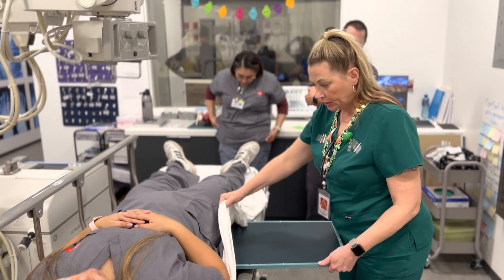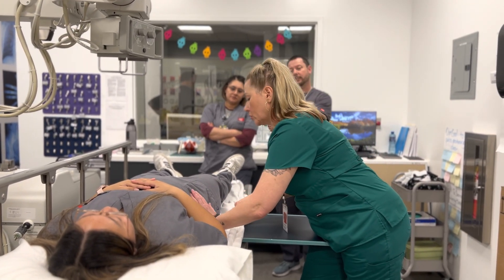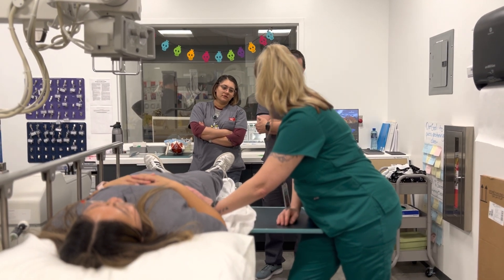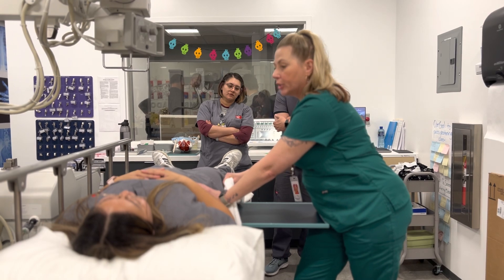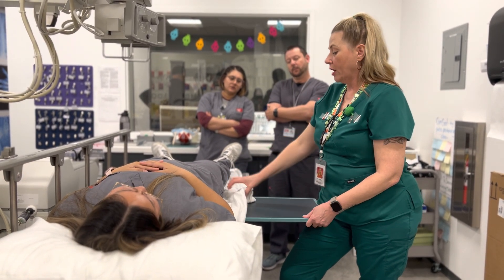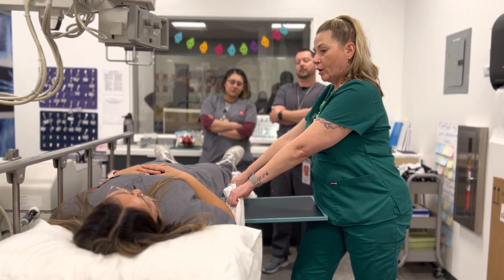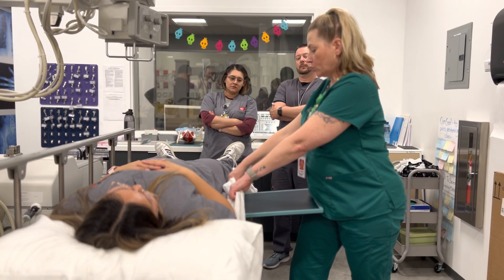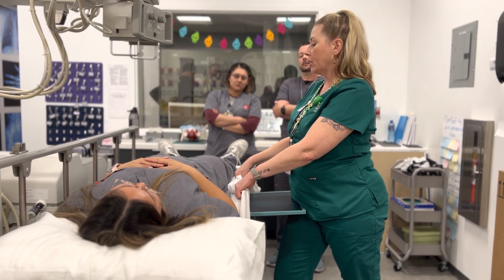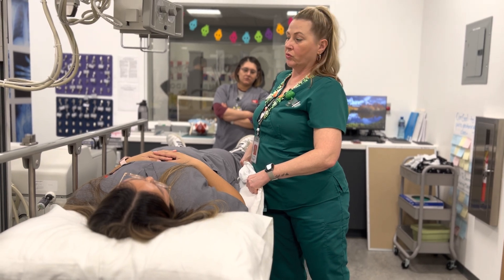I grab my sheets. I'm going to say, 'I'm going to feel for your hip.' I feel for her hip, then I see with my eyeballs — is it at that level? Yes. So I have the IR set on my hip. I'm going to put both hands on the sheet and pull tight, then lift up with my hip a little bit just for that initial insertion. Once I get past that initial part, I drop lower and push it all the way in with my hip.